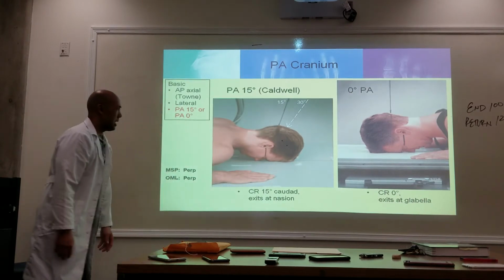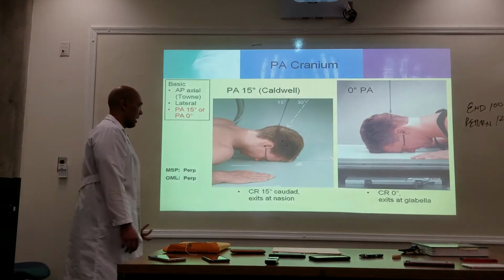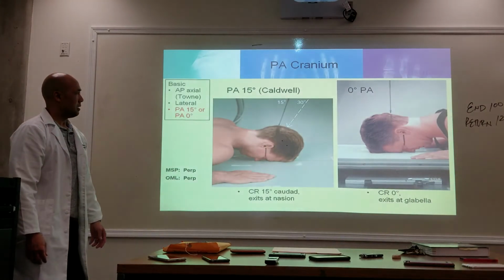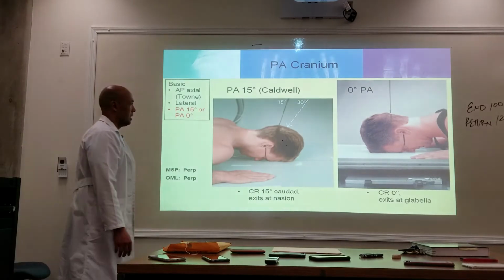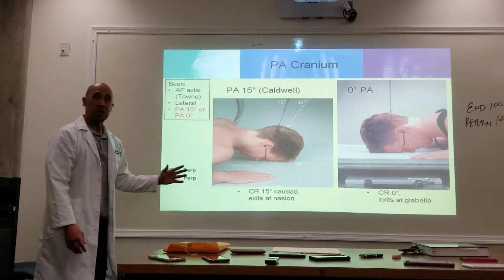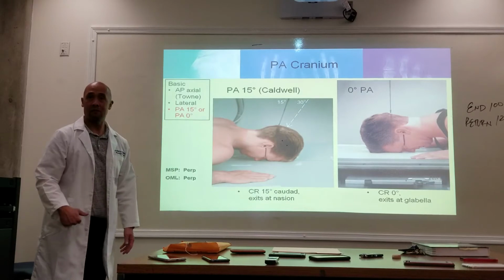Now, if the patient can't stand up and they can't be face down, what is that 30 degrees? It's in the next slide. I'll explain that to you later on. So if they can't be prone, can we do it supine? Yes, AP. Yes, we can.